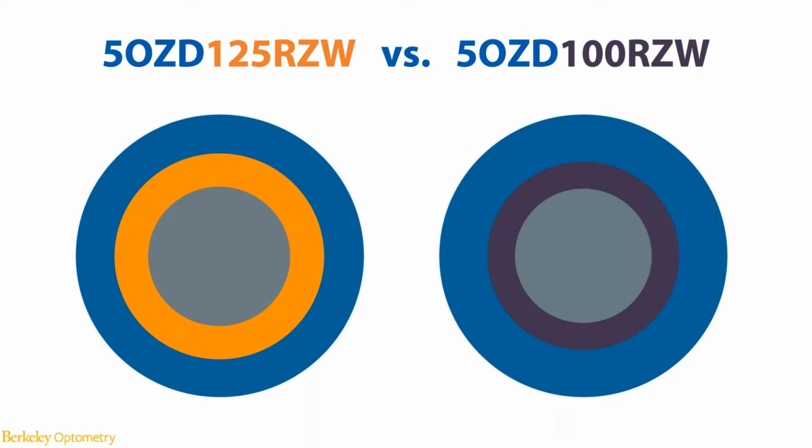So our general goal is to really understand the performance of CRT lens in a smaller optic zone diameter, but the next immediate logical question to ask is for that 1mm smaller in the optic zone area, where does that extra 1mm go? Do we want to have it all contributing to the landing area, or we want the return zone width and the landing zone area pretty much like share this extra 0.5 millimeter on each side?